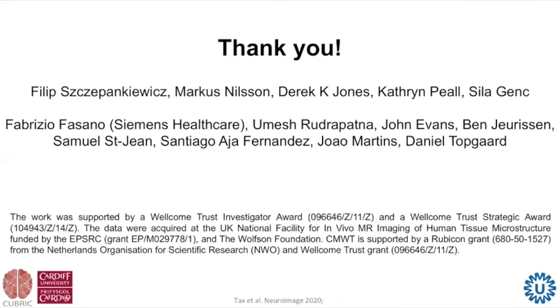Are those even bigger voxels? Yeah. 10 by 10 by 10? Yeah. You knew the answer to that question. Well, no, because once you get to those really high b values, because NAA has a much lower diffusion than water, you might actually start to get comparable signal to noise. Yeah. But things like fat suppression were quite challenging in the cerebellum, so there are definitely some challenges there.